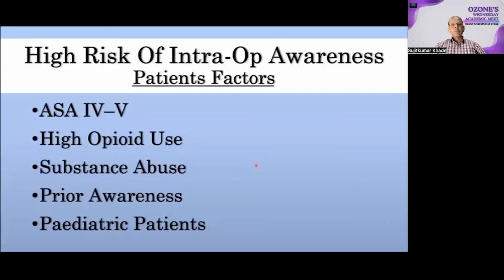There are cost constraints to use the BIS or end-tidal anesthesia gas monitoring systems because of the high costs. So now we are coming towards the last part of my presentation, that is the factors associated with risk of intraoperative awareness.